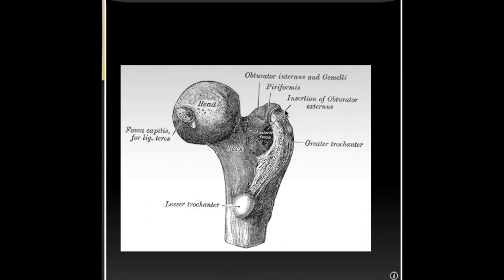And another important thing about osteosarcomas is that we should always assess with an MRI what we call skip lesions, and those are lesions that are not necessarily radiographically apparent and that are not necessarily adjacent to the main tumor or to the one we're seeing. So we might have normal bone separating another lesion that's going to be more distal. So that's why it's always important to assess proximally and distally from the site of the main lesion that we're assessing in the case of osteosarcoma, so we can identify any skip lesions that can potentially change management.